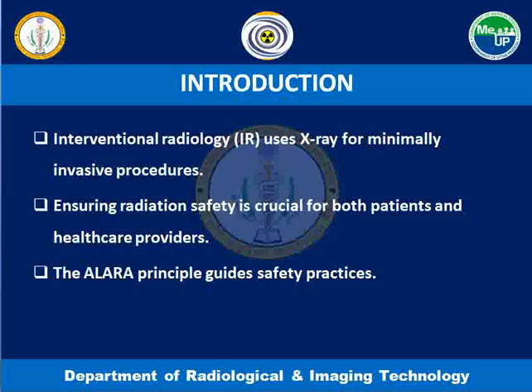In recent years, interventional radiology has advanced rapidly, resulting in a significant rise in the number of procedures performed. However, there is increasing concern about radiation exposure affecting both patients and operators during these interventions. Radiation exposure to both staff and patients should be minimized by adhering to the ALARA principle, which ensures optimal radiation protection by keeping exposure as low as reasonably achievable.